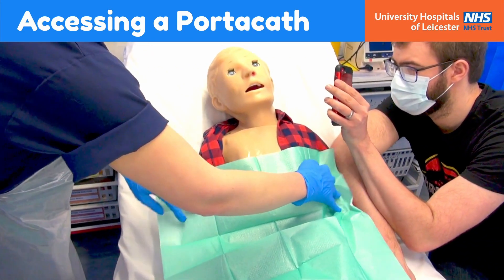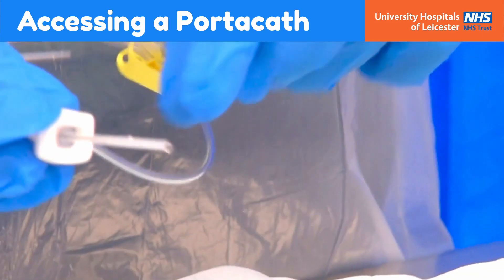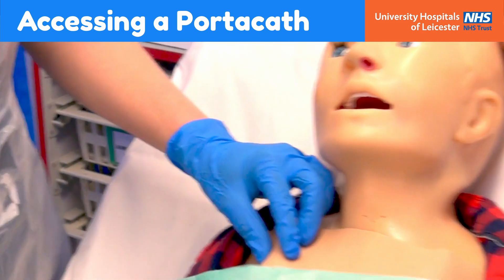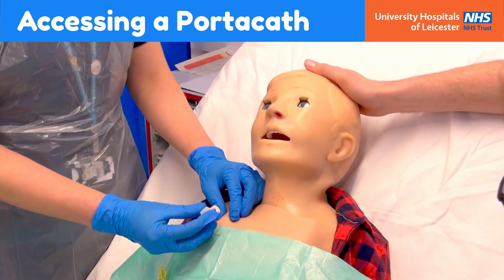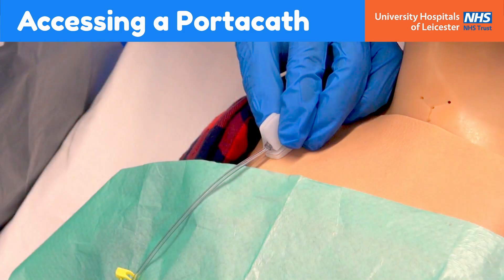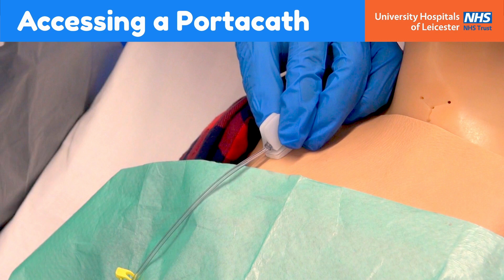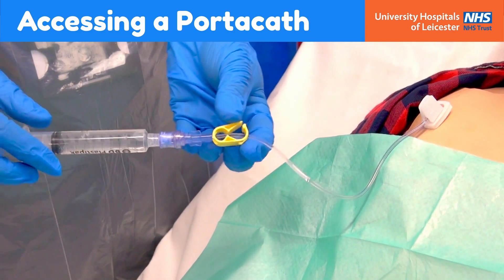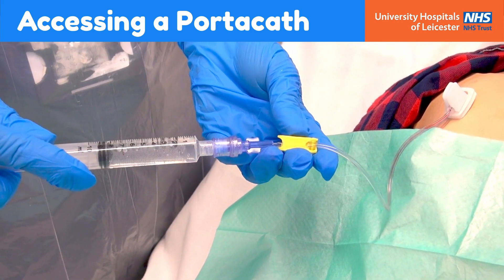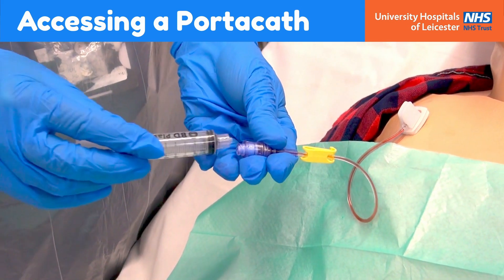Use the green drape to cover the area below. Secure the port hub between your thumb and index finger of your non-dominant hand, then use your dominant hand to hold the gripper port needle. Insert this at 90 degrees to the skin surface through the port hub in one firm, swift, continuous motion. The needle should be kept perfectly straight and inserted fully until it touches the back of the port chamber. Undo the clamp and slowly infuse 2ml of 0.9% sodium chloride. Ensure blood is aspirating well into the line and then clamp it.